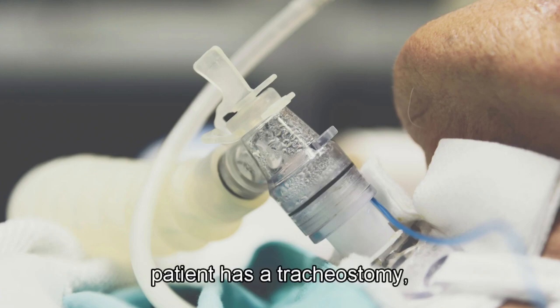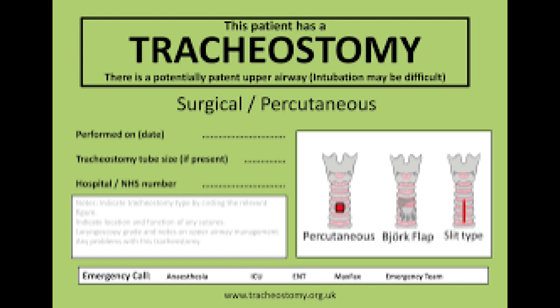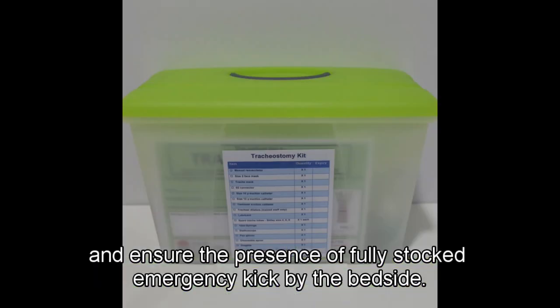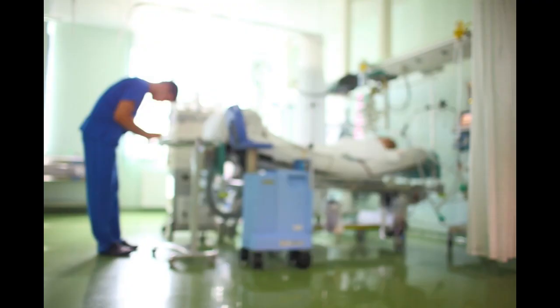If your patient has a tracheostomy, it's essential to check for the bedhead sign and ensure the presence of a fully stocked emergency kit by the bedside. No details should be overlooked.